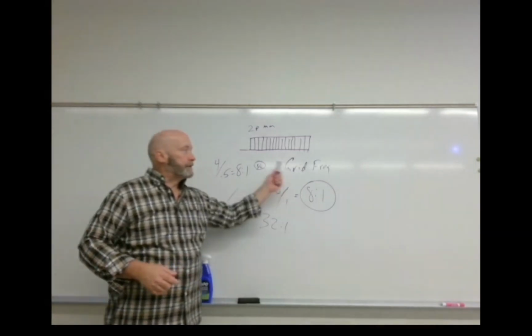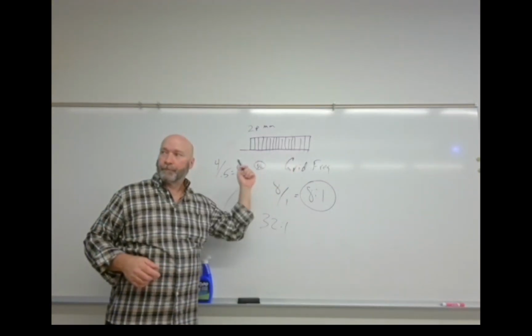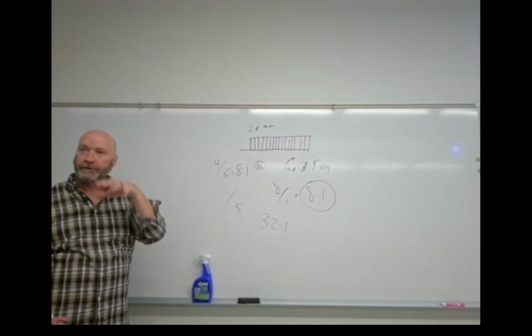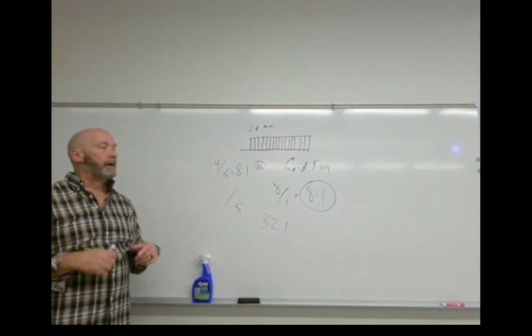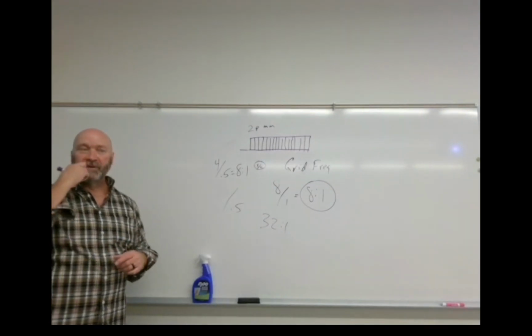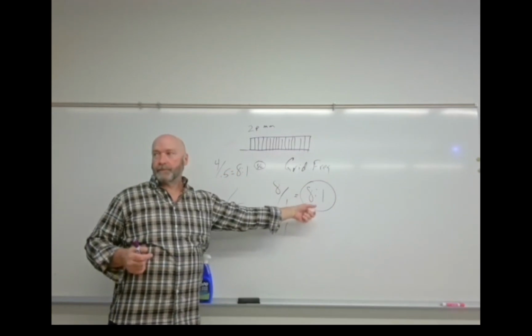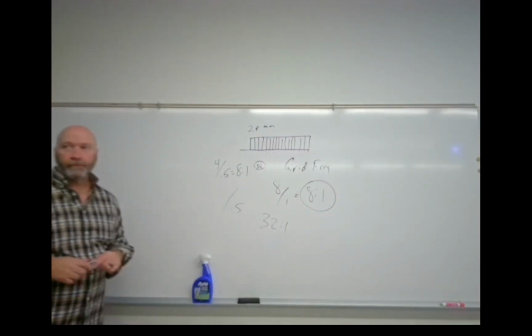Okay, so grid frequency is how many lines you have per millimeter. Grid ratio is the height of the grid strips divided by the distance in between them. Both are measures of grid effectiveness, but grid ratio is much more so. Okay?